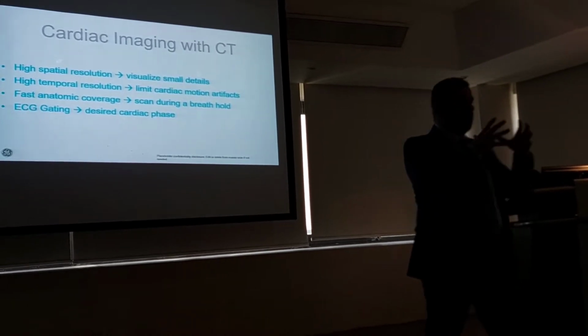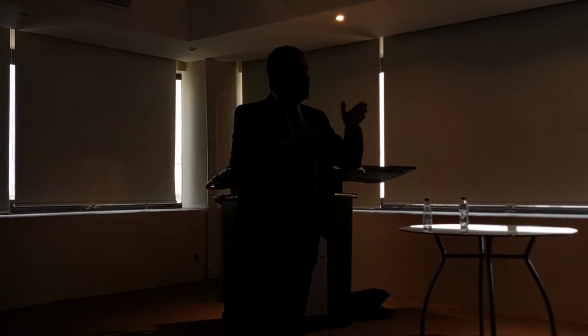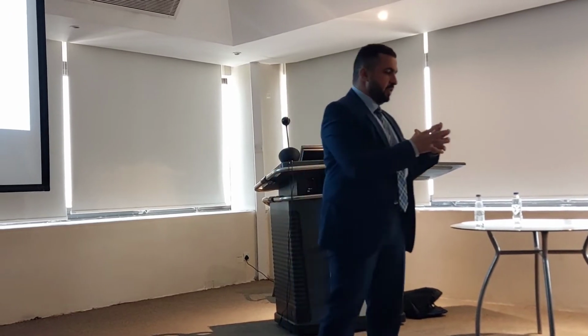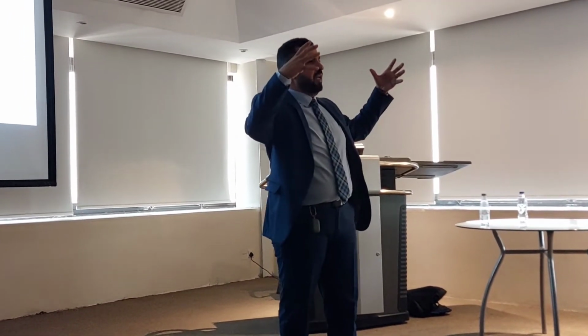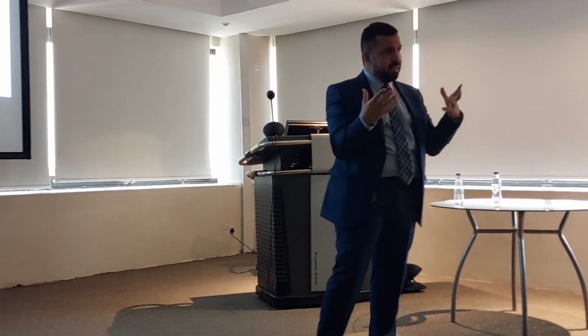Okay, so now if the patient's heart rate is 60 beats per minute, this means 1 beat per second. This means the whole cycle will take 1 second. Now, in the end-diastolic phase, it will have a few milliseconds, the heart preparing to pump the blood. Okay? So that's a still phase. There is the least motion. I will show you a graph based on that; it's logic actually, but still based on analysis, the phases where we can capture data that can give us still images that can be diagnosed.